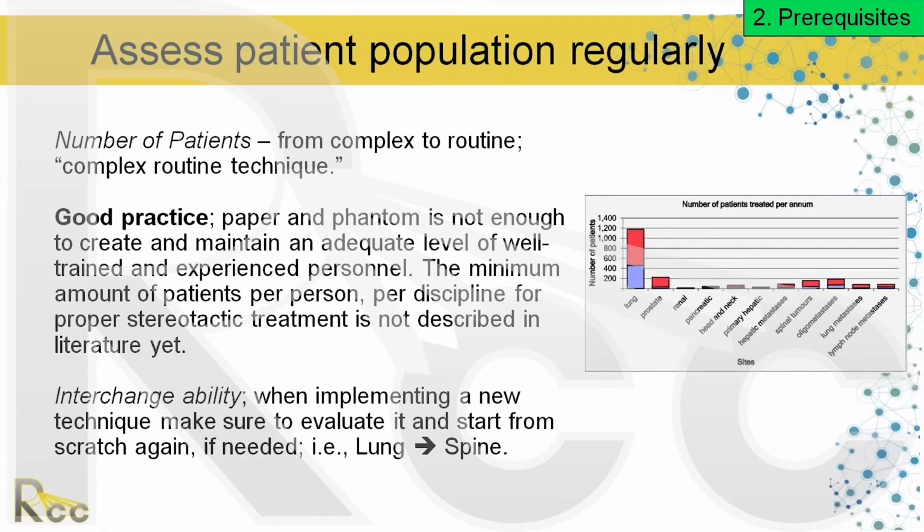And you should be reevaluating this from time to time to ensure that you're providing what you need to your patient population. And you may find that you don't need to provide this because you only have so many patients, so you're never going to get good at it. So we'll send those patients over to so-and-so who will get good at it. I think it's important that we recognize that doing these things infrequently is not always in the best interest of the patient. So doing one-offs, sometimes it feels good to do it. It's not always in the best interest.